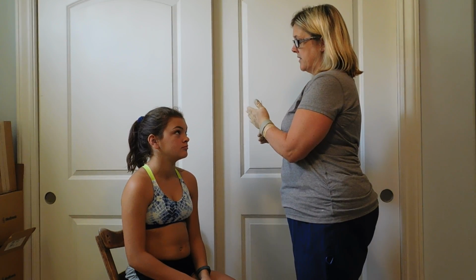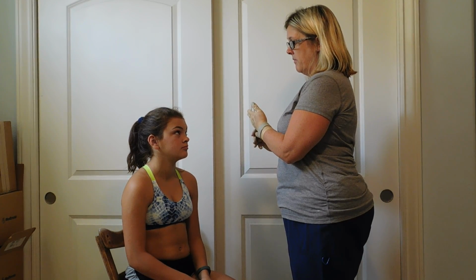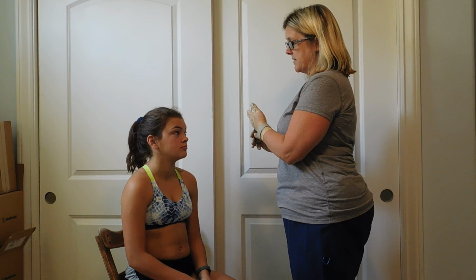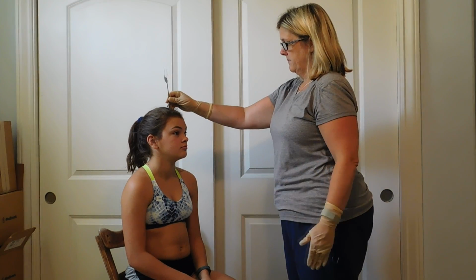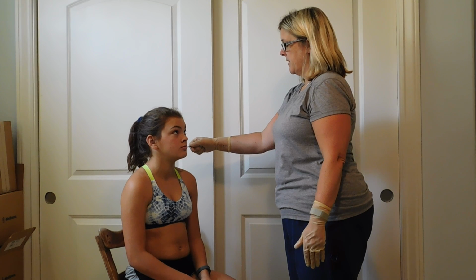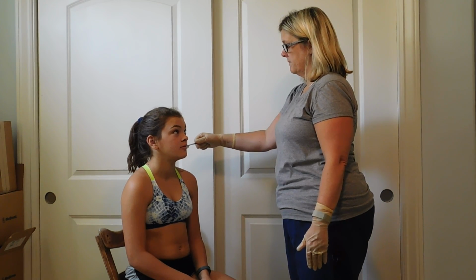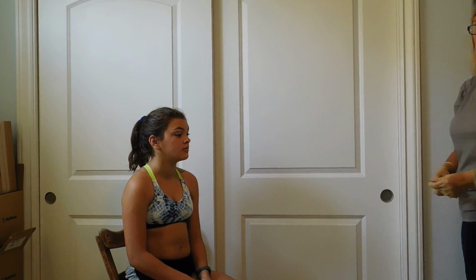Next, I'm going to be doing the Weber test and the Rinne test. I'm going to ask you to tell me if you're hearing the tuning fork from both ears or one ear, and identify which ear it is. Both ears. Tell me when you stop hearing. No. No. That concludes the hearing exam.